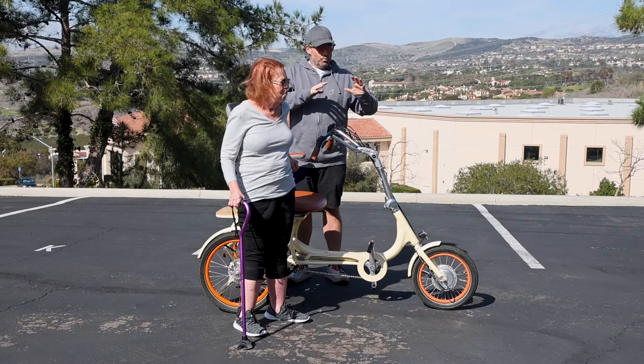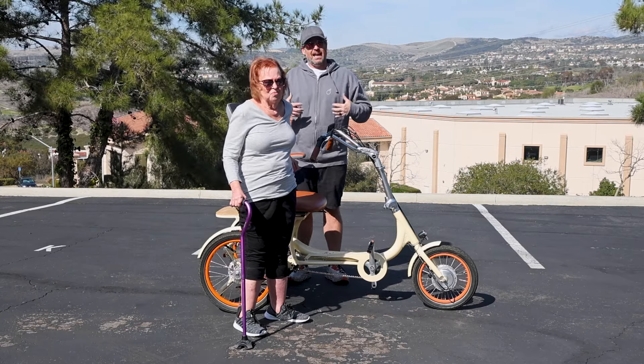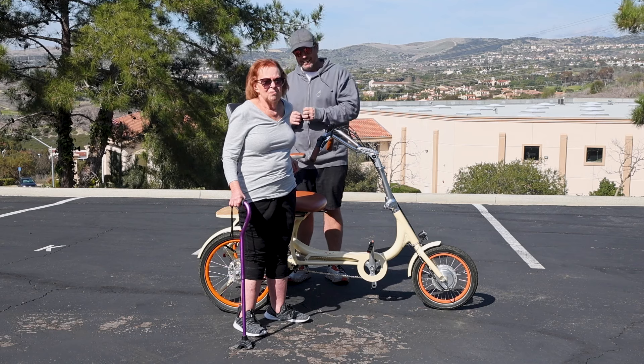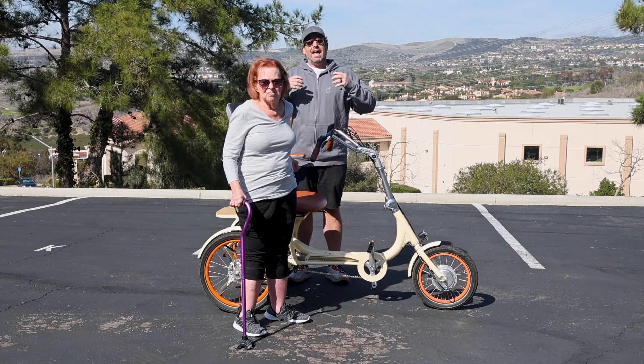We've designed an electric trike scooter that allows riders like my mom to still pedal, get out and get exercise, but be comfortable while seated. Today we're going to show it to you and have her demonstrate.